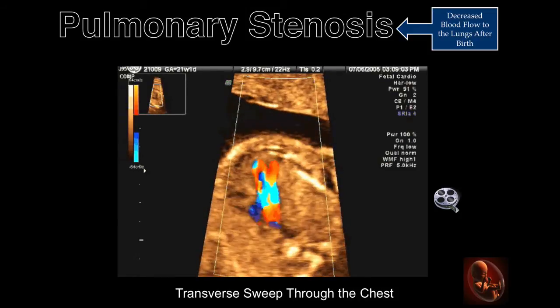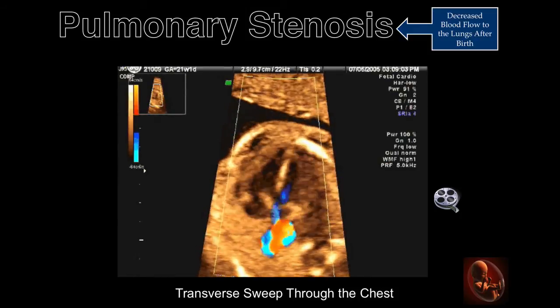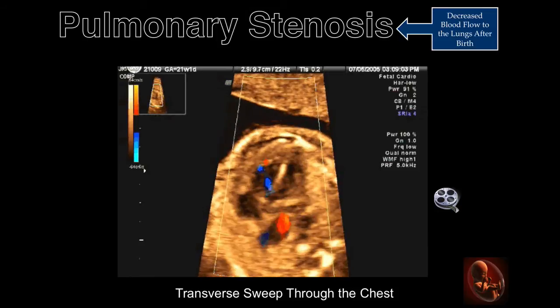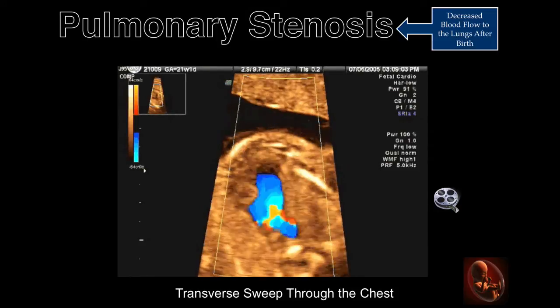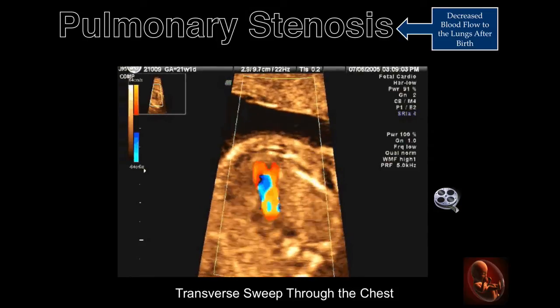This is a cineclip of a transverse sweep through the chest, illustrating the changes observed in the three previous slides.